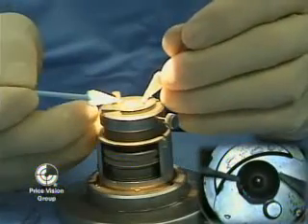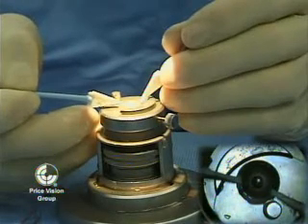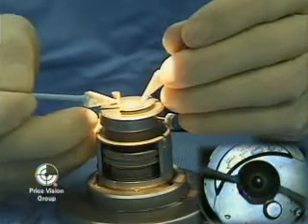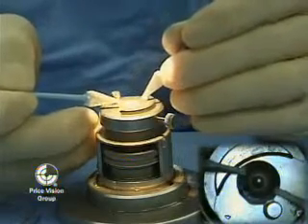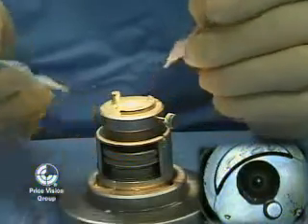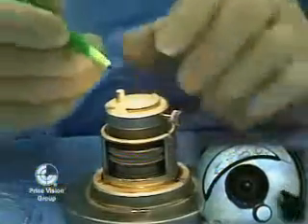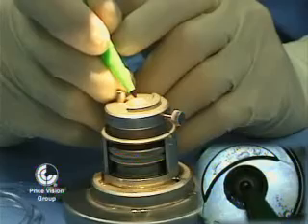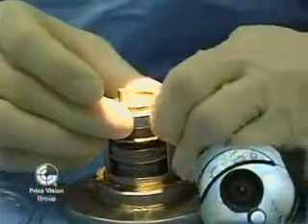Once the corneal cap is in position, I'm going to use Weck-Cel sponges to dry the gutter around the edge, just like you would with any free LASIK flap. Make sure the alignment is symmetrical. And once the cap is in position, I'm going to take gentian violet once again and mark the very center of the resection. Essentially here, the center of the pupil. And we'll use this mark in a little bit to line it up with the cutting block.